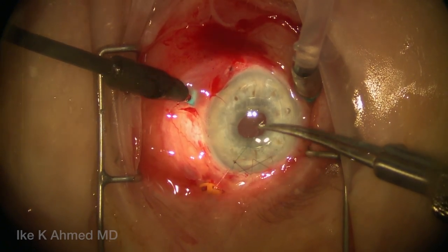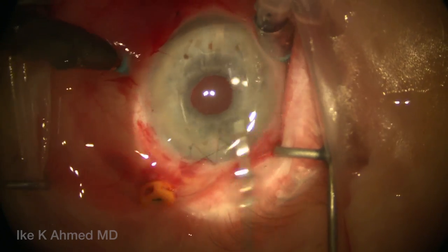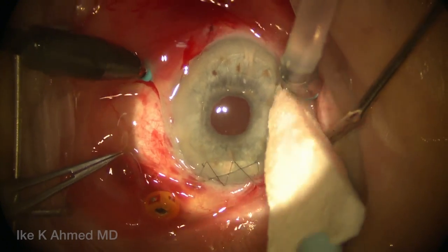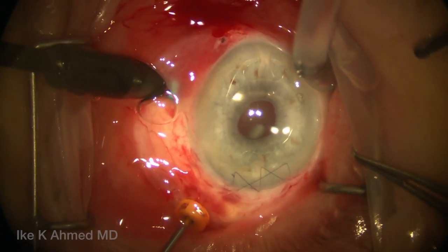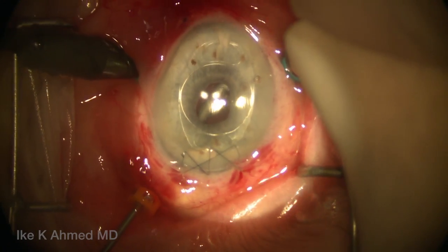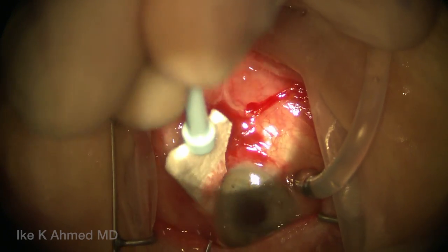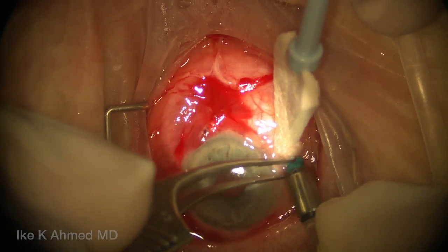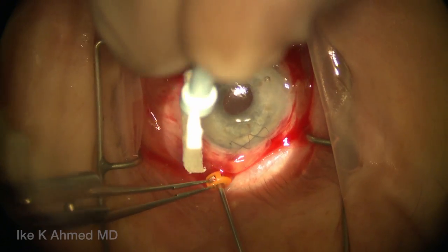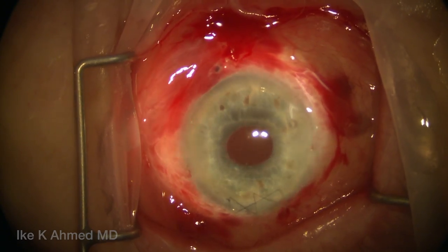At this point, we can lock our suture and confirm the closure by rotating the knot into the cornea. We'll hydrate our main corneal incisions. We do all this work in the anterior chamber first, prior to removing the vitreous infusion line and the pars plana ports. Further vitrectomy is performed to ensure the space is entirely clear of vitreous anteriorly and around the ports. We then remove the chandelier light, pulling the 25-gauge trocar out while placing pressure posteriorly. We do the same with the infusion line and the cutter, pulling the trocar through the cutter on position two as we remove the vitrectomy probe. These sclerotomies are self-sealing and the case is completed.